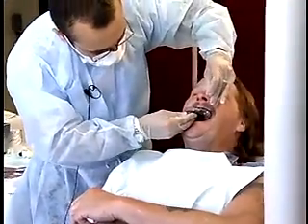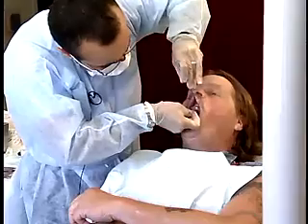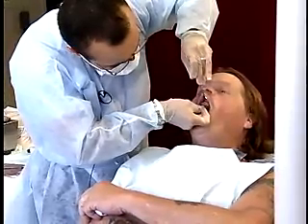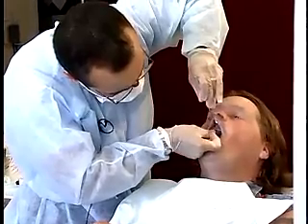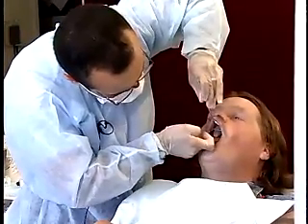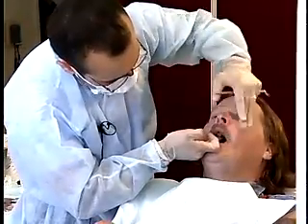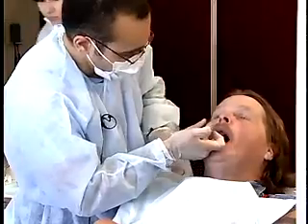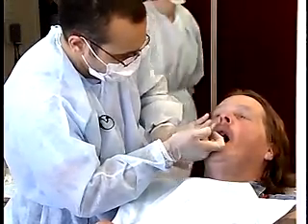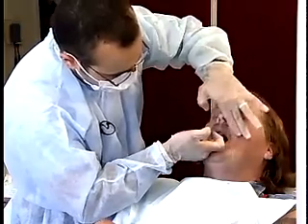Remove the gauze from the patient's mouth. Standing to the right of the patient, rotate the tray into the patient's mouth. Place the index finger on the posterior rim and fully seat the tray. The vestibular tissue may be briefly and lightly border molded for about 30 seconds after the tray has been seated. Retain the tray in position with finger pressure at all times.